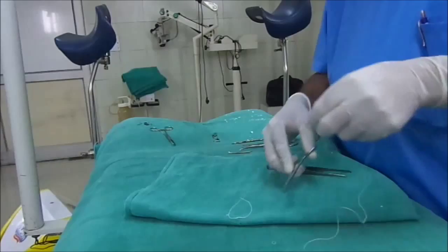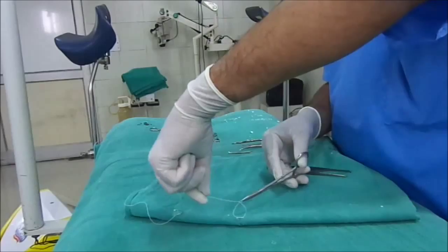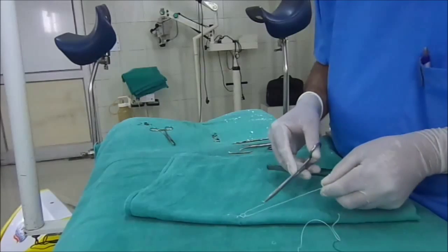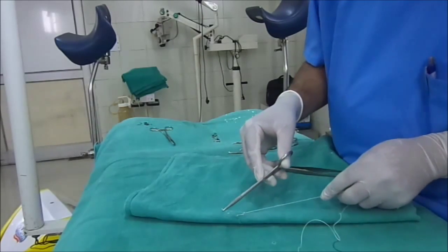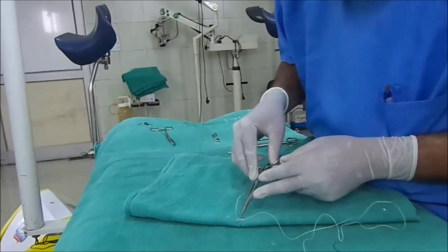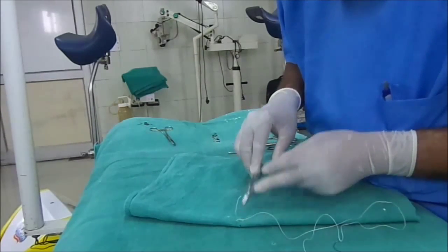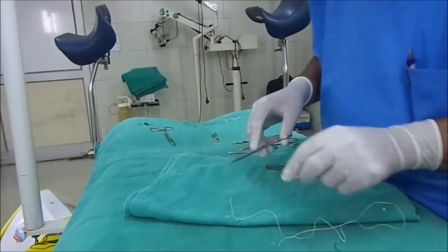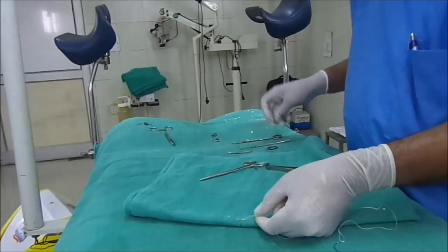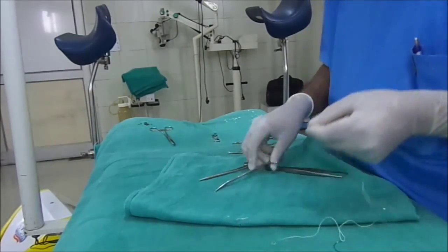In the same way we make a reverse loop — like that. Care must be taken that the knot should not be at the wound margin; it should remain at one side of the cut skin margin. So this is the ideal knot. There is no need to give many knots — only the primary and secondary knot is sufficient. So this is the ideal thing.